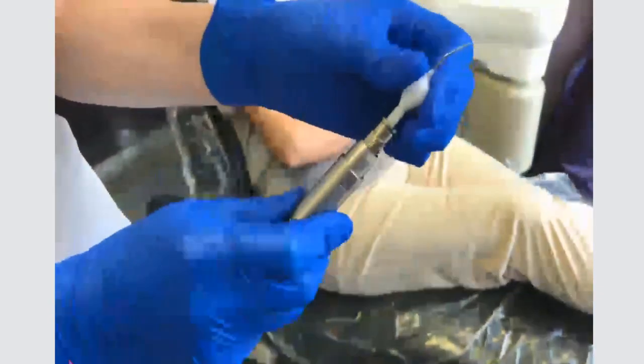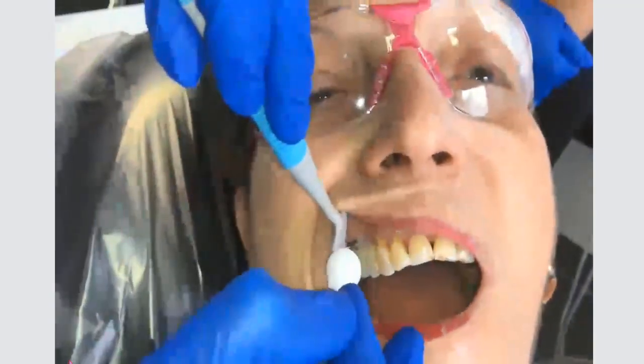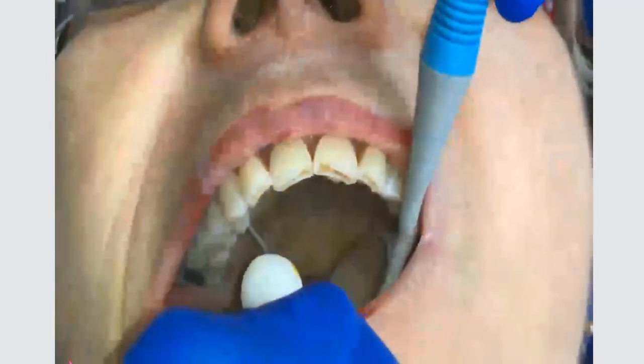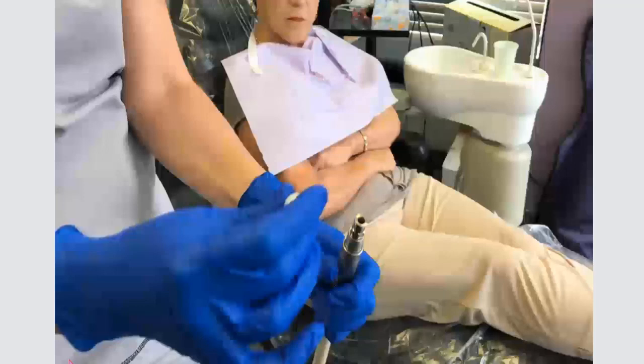So the adapter goes on. Each unit is good for 3 to 5 teeth. And again, we're talking about implants, but this can be used anywhere in the mouth. So you see how it's being used as a brush. It's difficult to tell in this, I know the clarity is not that great, but you're going to continually move that around at a 30 to 90 degree angle to the tooth. There's no water coming out. You can rinse if you want. The beauty of glycine is that it's absorbed by the body.